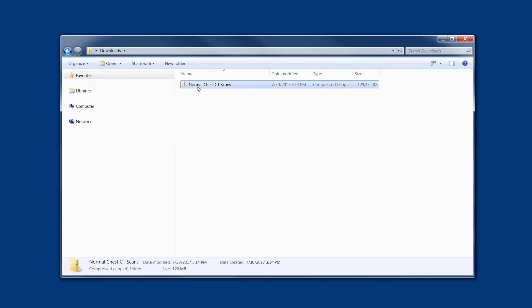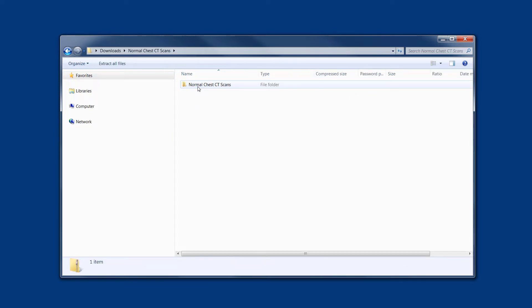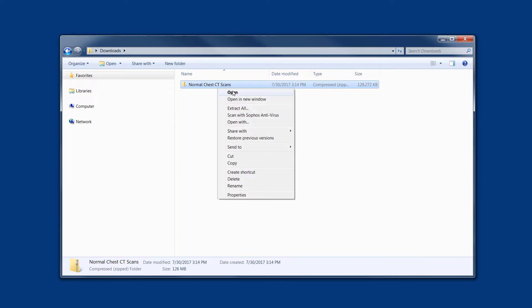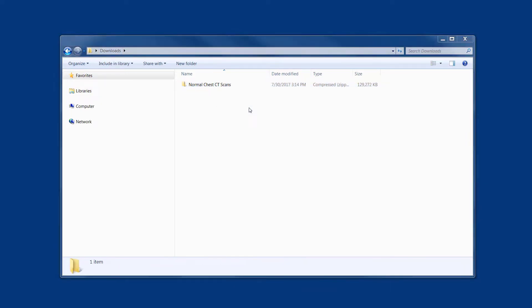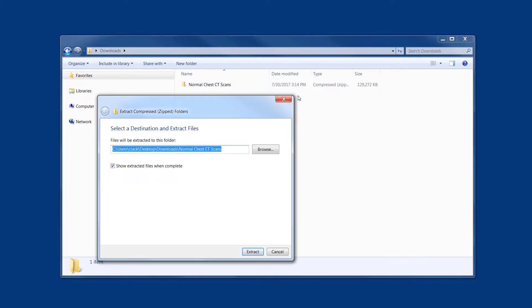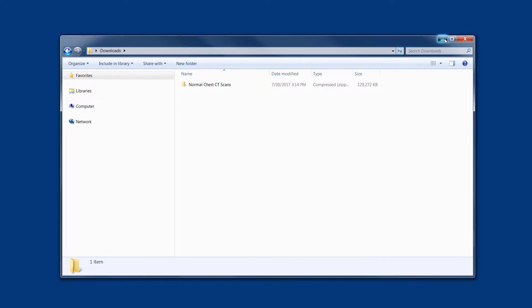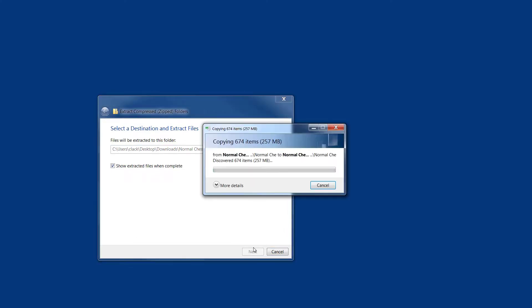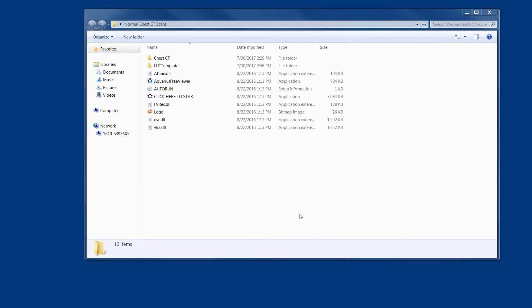Go ahead and unzip the file by right-clicking on it and selecting 'Extract All'. Choose where to extract it. After the file has extracted, go ahead and open up the folder.